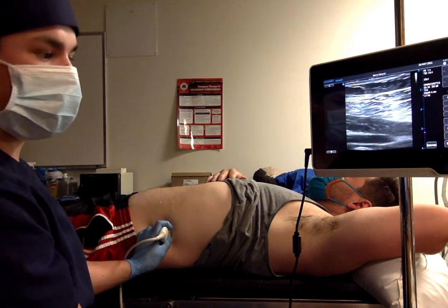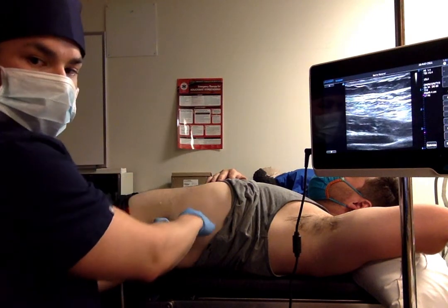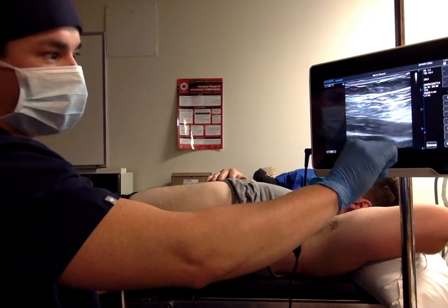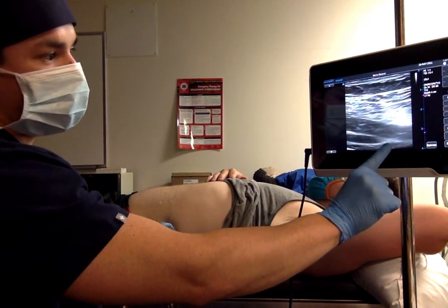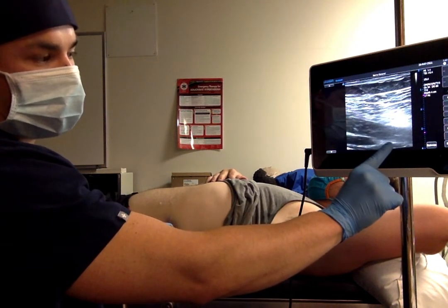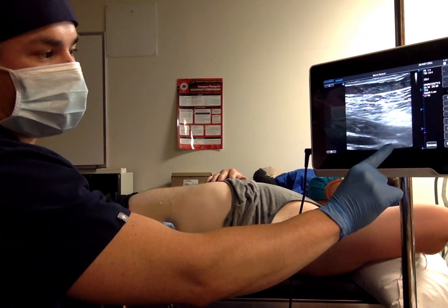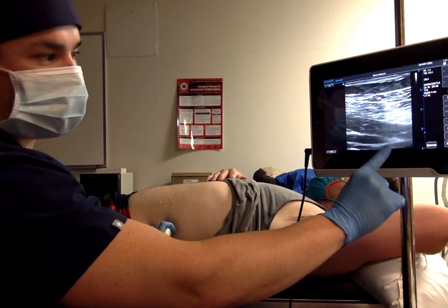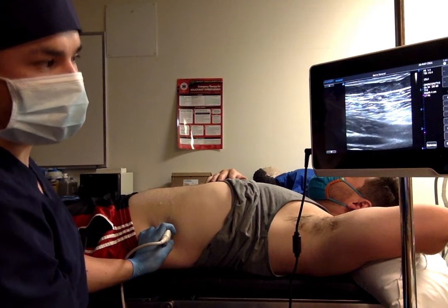This approach, we use our needle and we go superior to inferior, directly down, and then we'll have our assistant inject normal saline into this fascia and then hydrodissect that. Once we know that we're in the correct area, we can have our assistant aspirate and then inject 20 to 40 cc's, depending on the concentration and dilution, of 0.25% ropivacaine.